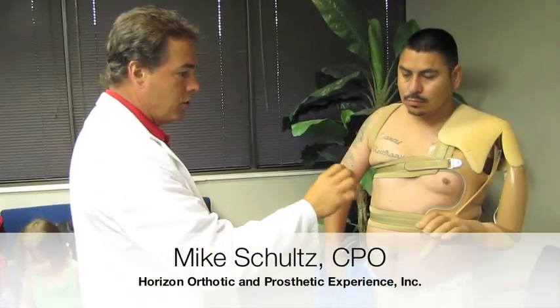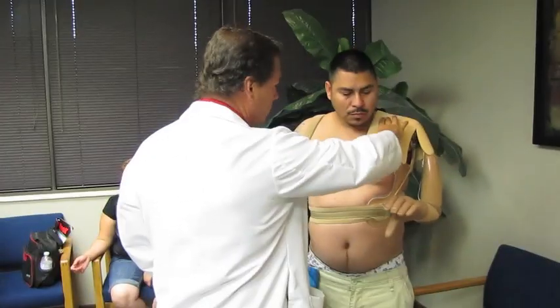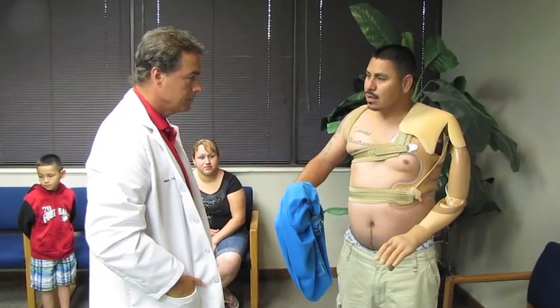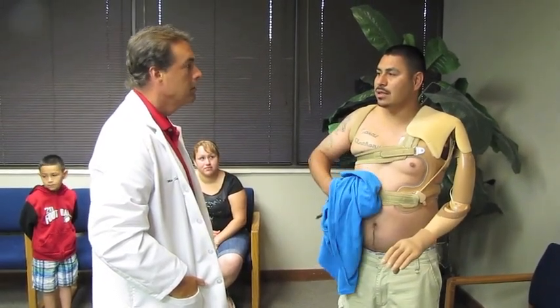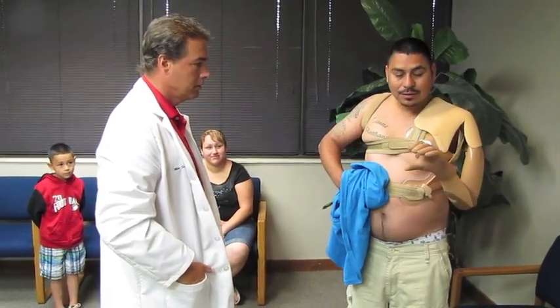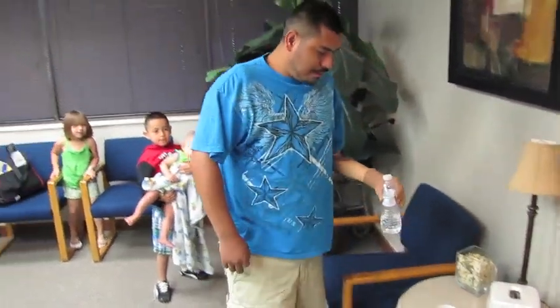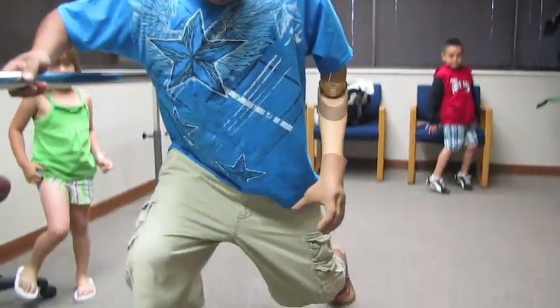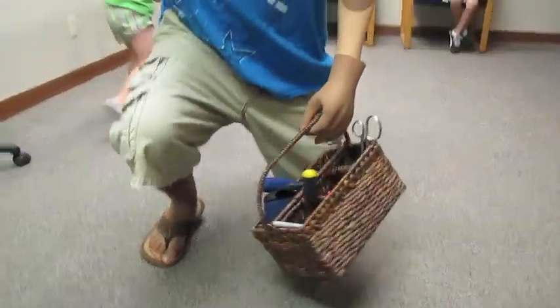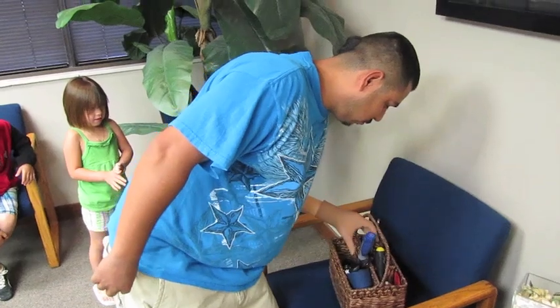In order to switch between the rotation and the opening and closing of the hand, you've got to hit both these electrodes at the same time real quick, and that'll switch it. Because the other guy — you remember he said — I need to relax and go fast. I need to practice, but I like it.